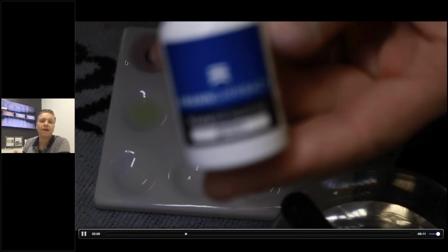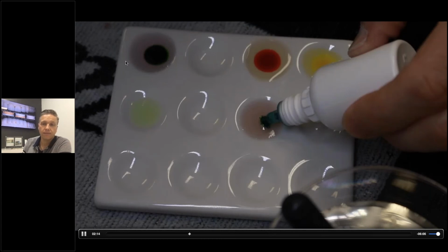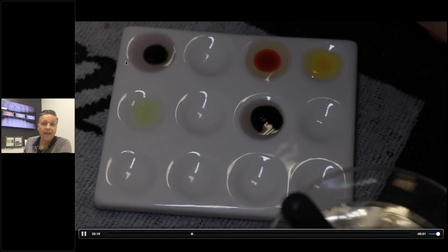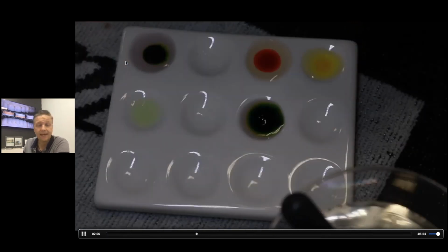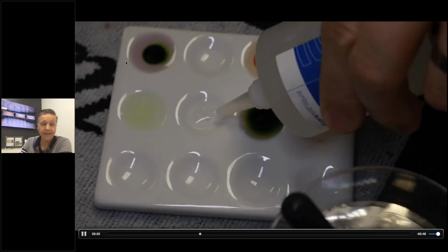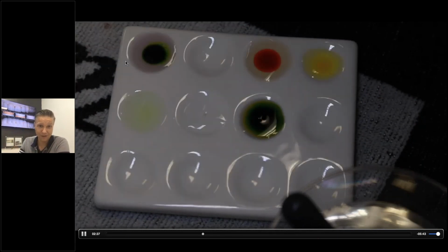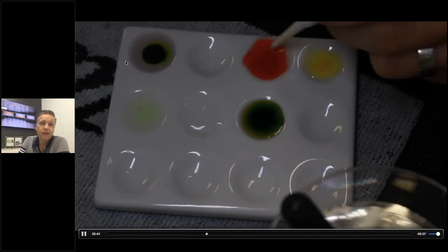So you see I'm setting up my tray. That's what I usually do for a bigger case. I'm laying out my colors and then putting my marker colors in here. It's almost like setting up my porcelain tray with porcelain, or my glaze and stain tray with stains. It's the same thing. You set up your colors. Usually I write down where everything is, or I put the bottles in the right position and make a quick smartphone picture. Then of course I mix it, so that everything is well saturated.